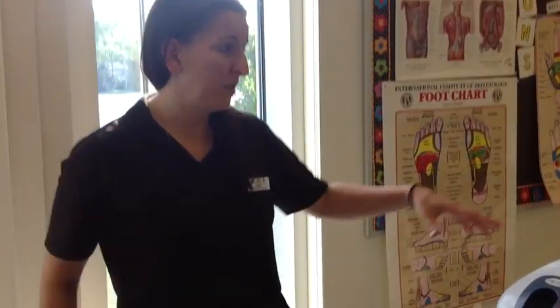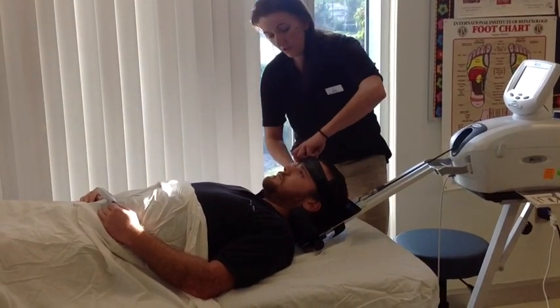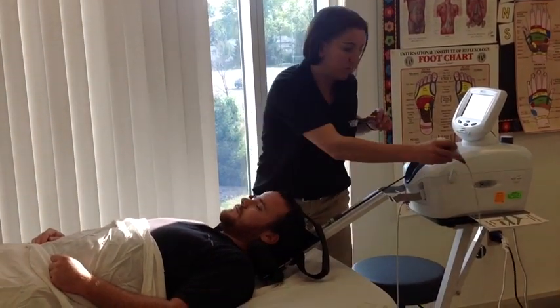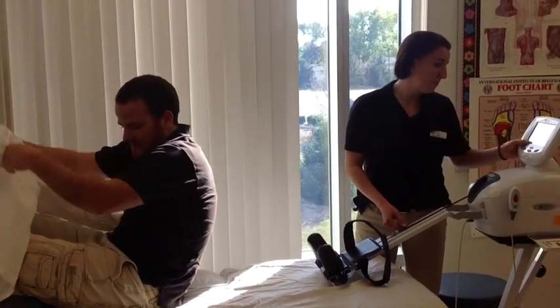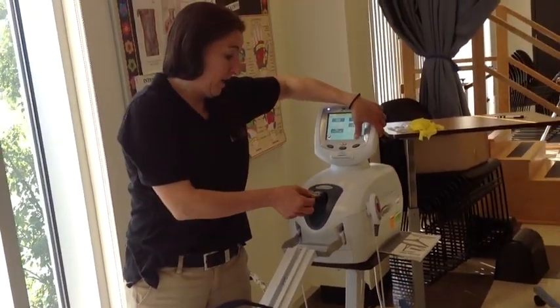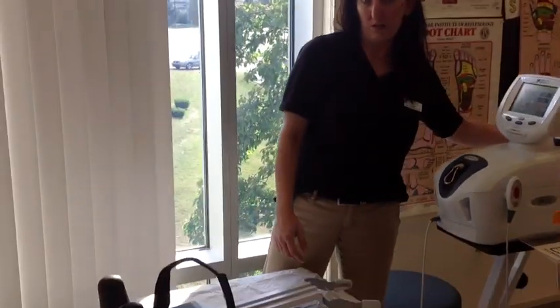After the treatment is completed, the machine will stop and the straps will release. Then go ahead and let out the patient's head and unstrap them. Make sure that if your patient is claustrophobic or has any sort of anxiety, you explain to them what's going on so they don't panic in the middle of the treatment. Once you get the patient up off the table, hit the roof release — remembering to hold it down the whole time — until you put it back, then remove the attachment, undo the bed, and turn off the machine.